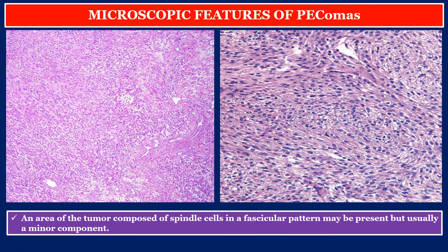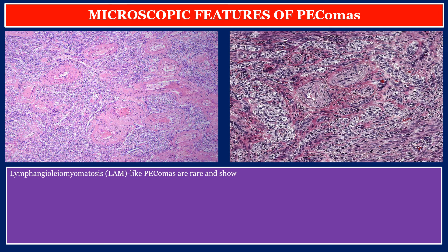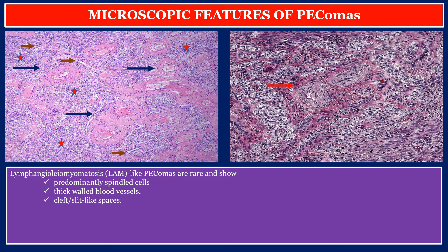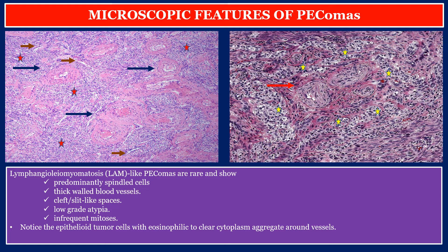An area of the tumor composed of spindle cells in a fascicular pattern may be present, but is usually a minor component. Lymphangioleiomyomatosis (LAM)-like PEComas are rare and show predominantly spindle cells, thick-walled blood vessels, cleft slit-like spaces, low-grade atypia, and infrequent mitosis. Notice the epithelioid tumor cells with eosinophilic to clear cytoplasm aggregating around blood vessels.